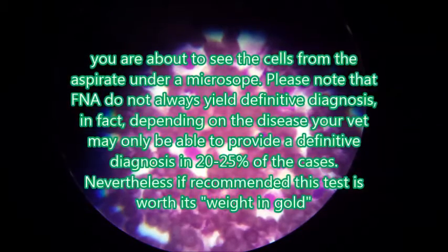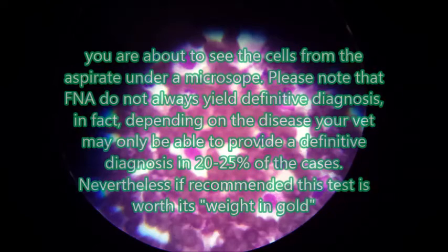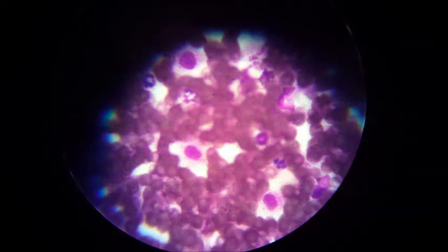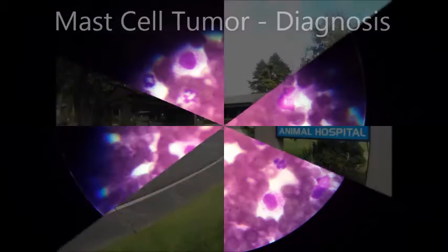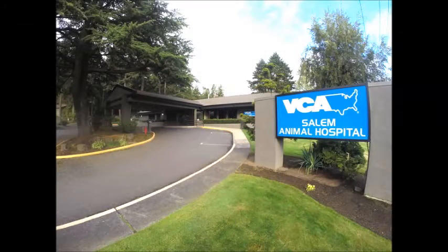These are the slides under the microscope at 400x. We have some blood in the background, we have neutrophils which are a normal type of white blood cell, and then we have a higher number than expected of mast cells. Those are the cells with a dark nucleus and small little speckles. The diagnosis here is a mast cell tumor, and so this patient will need to go to surgery to have it removed.